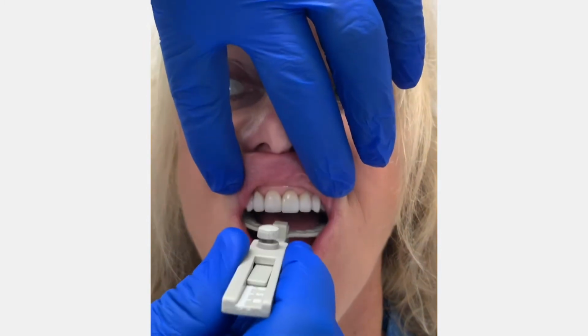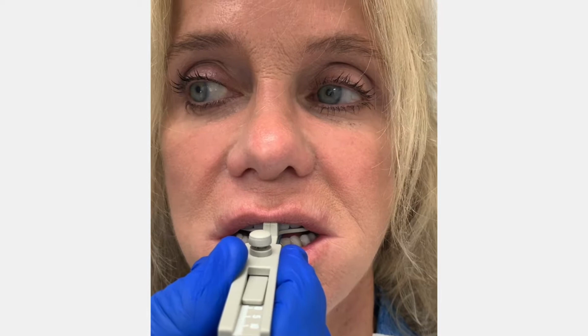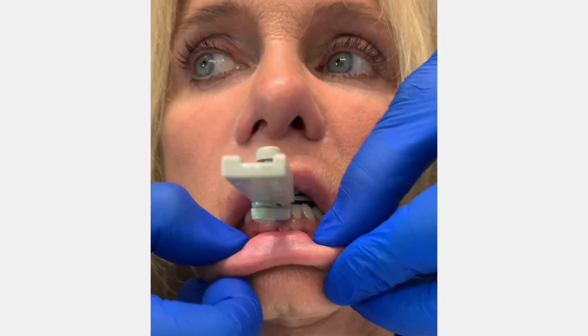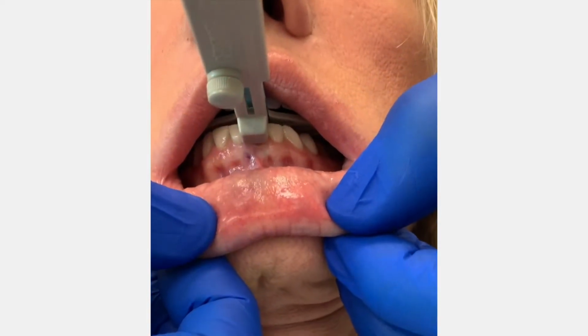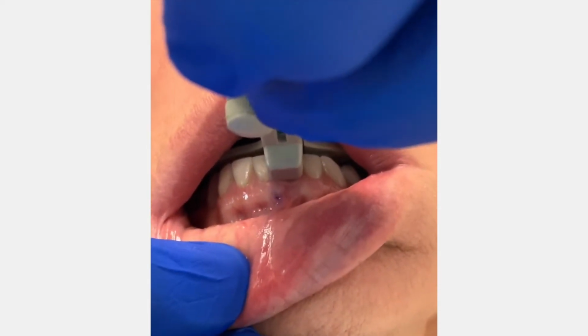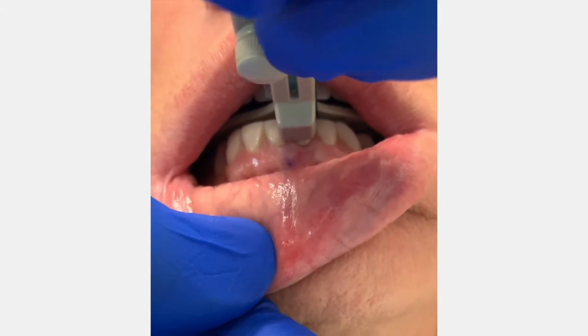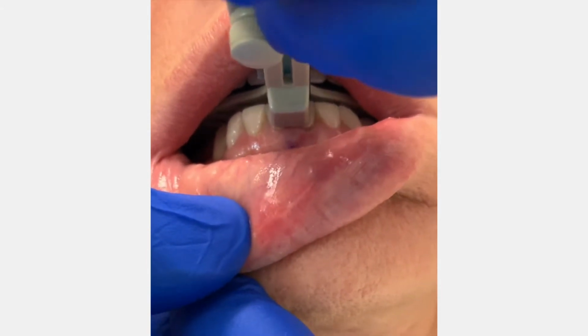Here is a much simpler way to take a bite registration for those patients that have a tendency to deflect to one side. Place the bite fork in the mouth and center with the upper midline. Have the patient slowly close, and again, we can see this patient deflected off to one side. Hold the fork in place with the upper midline. Slowly have the patient move the mandible until the lower midline lines up with the center of the little gray block.